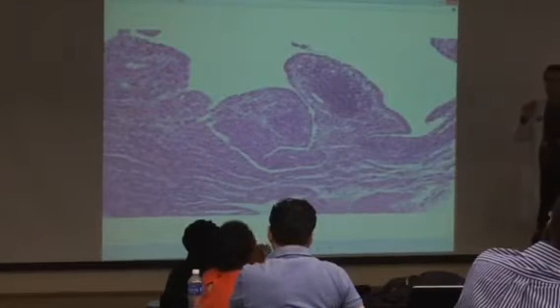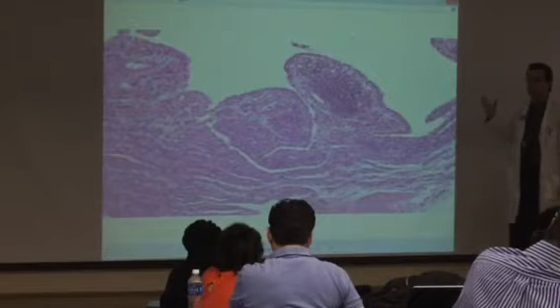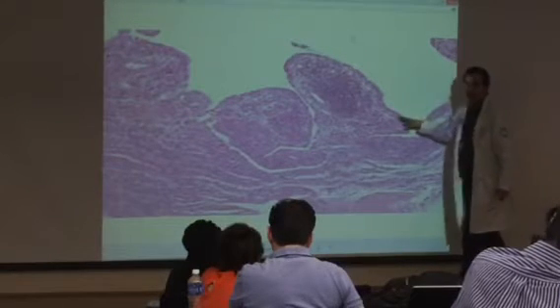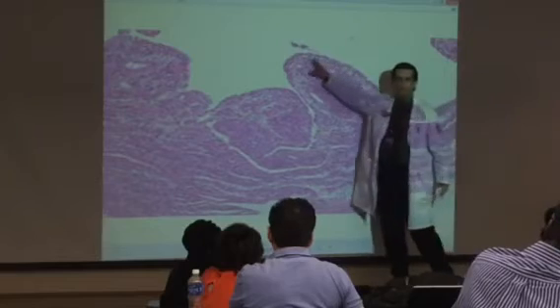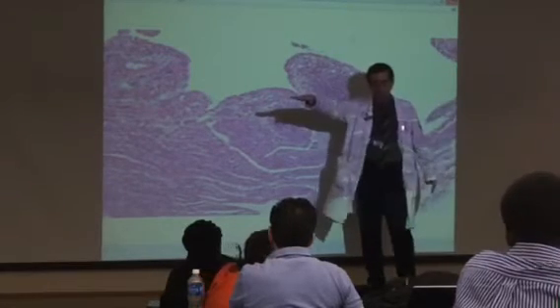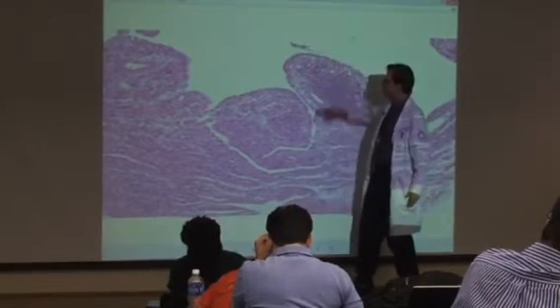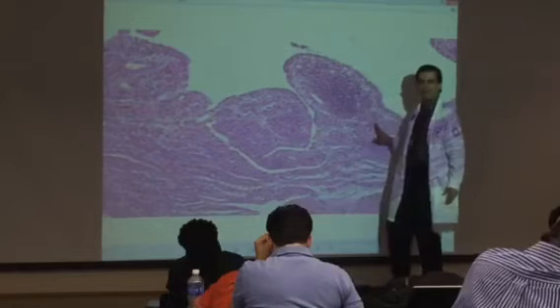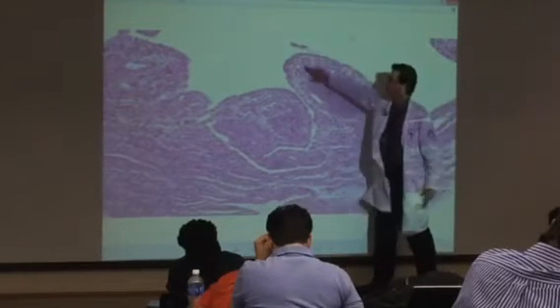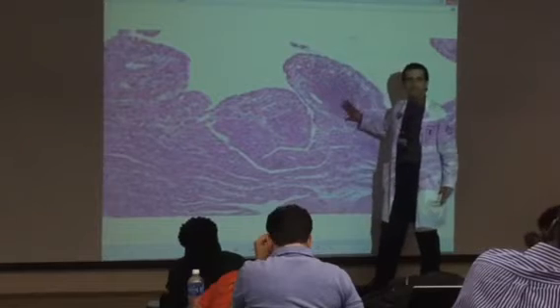What you see here, a very important buzzword for rheumatoid arthritis, is this structure. These structures are hyperplastic synovial tissue. Synovial tissue should be lined, kind of flat. You see here, this is the joint space. You see this synovial tissue, how hyperplastic, kind of papillary, protruding inside. And inside this synovial tissue, lots of inflammatory cells.